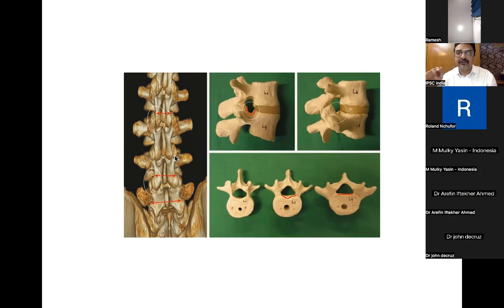Those who attended the workshop, we had a good discussion for almost 3 days on this. I showed them how much difference it makes whether you're working at L5 S1 or at L2, L3. So there should not be any fixed criteria of degrees and centimeters from the midline. Are you getting my point? Yes, sir. Okay, great.